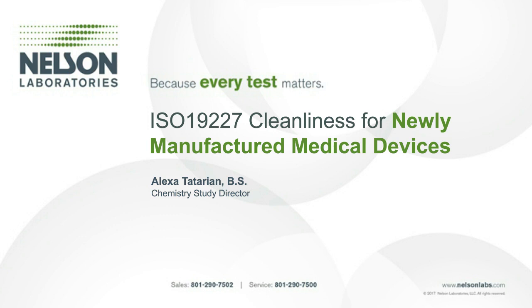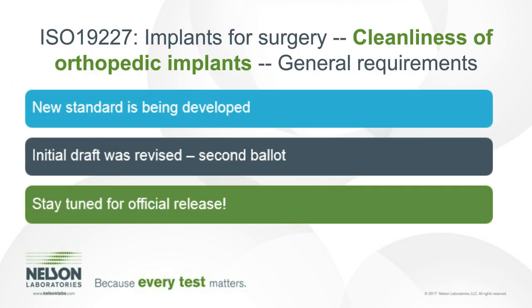So I want to first start off by mentioning this new ISO document. This is exciting. It's a new standard being developed called Implants for Surgery, Cleanliness of Orthopedic Implants. It does have the word orthopedic in the title, but I will say that this can be used for really any device or product where you want to target those initial manufacturing or cleaning residues, but especially the bread and butter for this standard will be orthopedic implants.